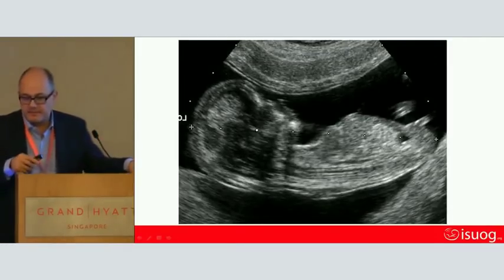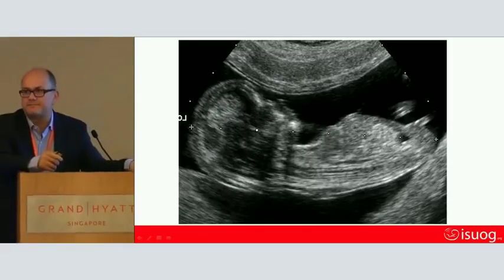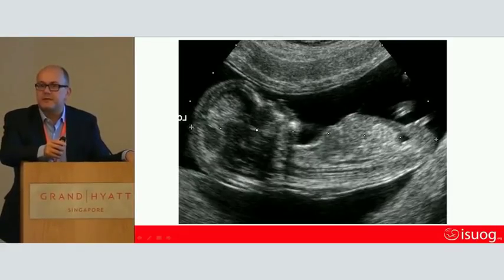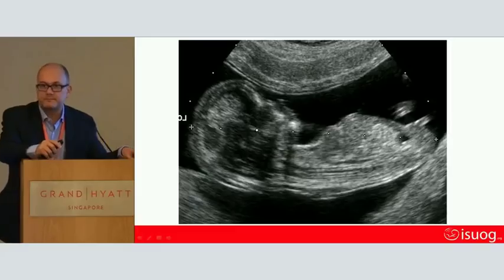So, this is an image of the crown rump length. Good image? Bad image? Someone says good. What are the criteria that we are looking for? Shout them out to me. What criteria are we looking for to say this is a good image or not a good image?